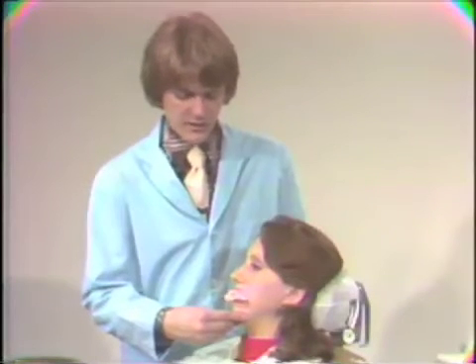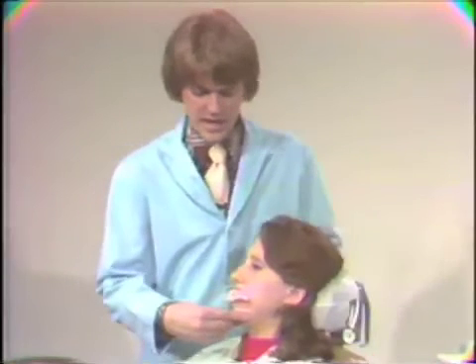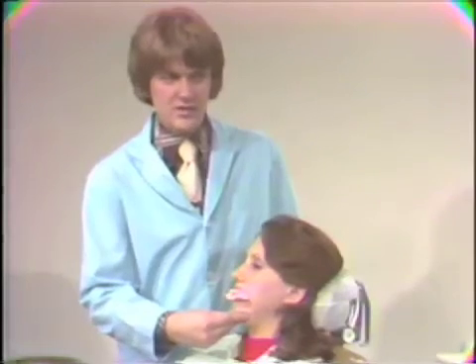Okay, now once we've completed our second recording, we'll use a ball of heated compound. Okay, stop right there. We'll place the patient in the centric relation position, and we'll take our heated compound and press it against this anterior region, against our little jigs here. We'll show this when we get into the lab.